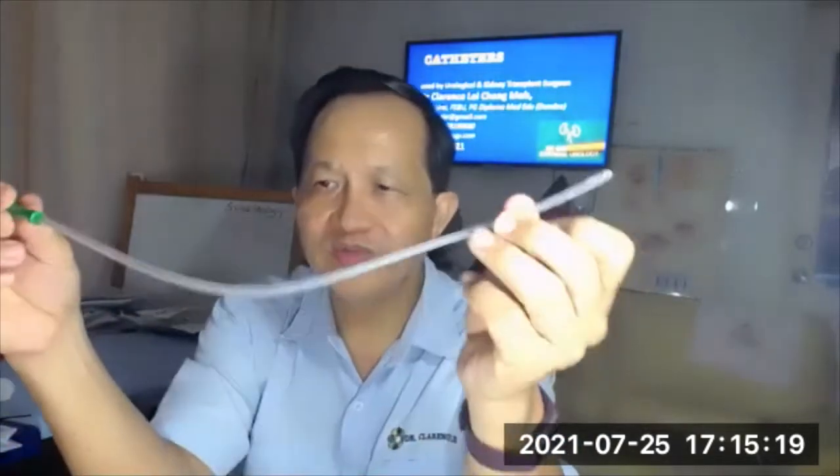If you just want to do drainage of blood clots or debris, you can put in a single lumen catheter, size 12 for example — the lumen is very big. Or you can use a bigger lumen, size 16. This is a single lumen, no-balloon catheter. The lumen is very big — you put it into the bladder and use it for irrigation. For children with debris in the bladder, you can put a smaller size, like size 10. These single lumen catheters are also useful for catheter drainage.